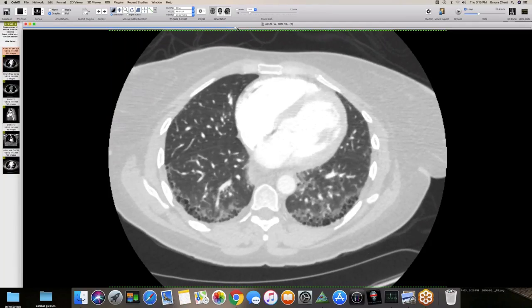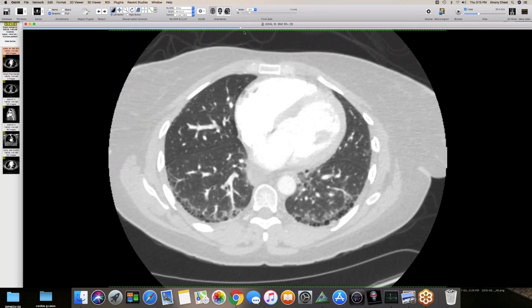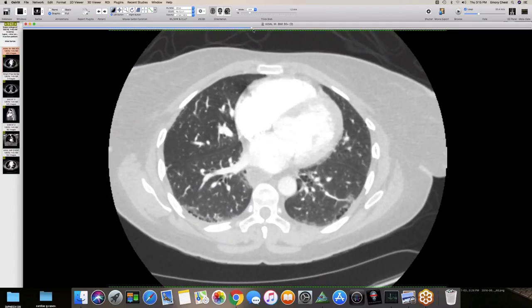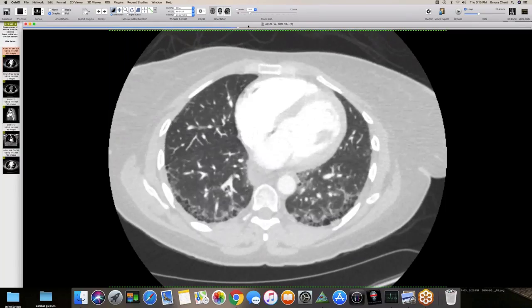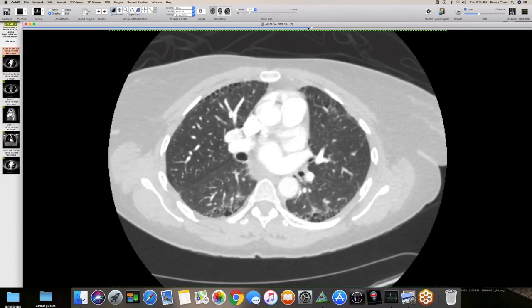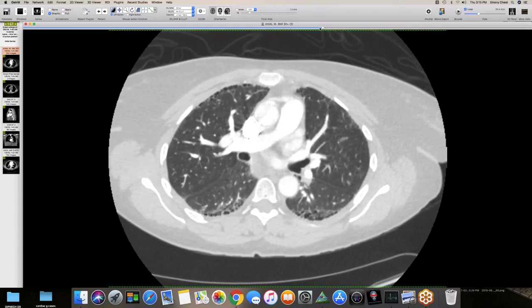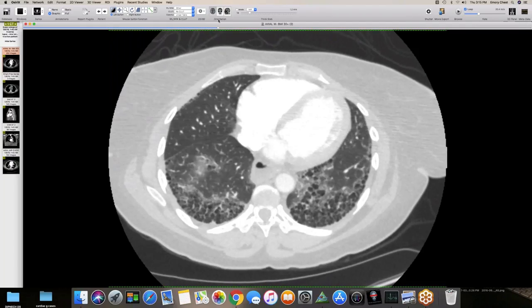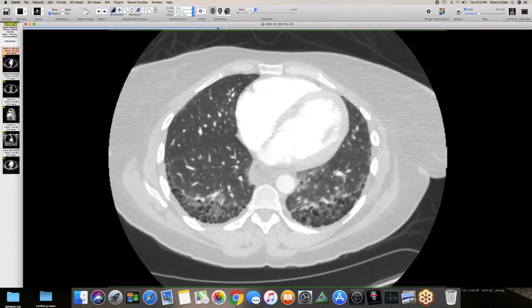We're finding more and more of these cases. Jonathan Chong has recently published articles on the signs involved here: the straight edge sign, more common in connective tissue related lung disease than IPF; the anterior upper lobe sign with fibrosis in the anterior upper lobes; and the four corner sign — well-defined areas of fibrosis that are anterior and posterior. A nice case of lupus-related lung fibrosis with all the classic signs.